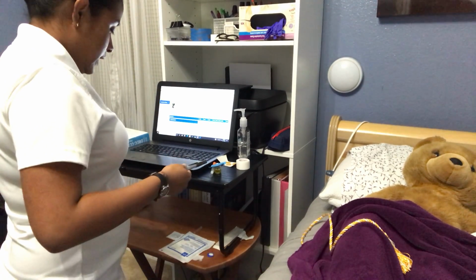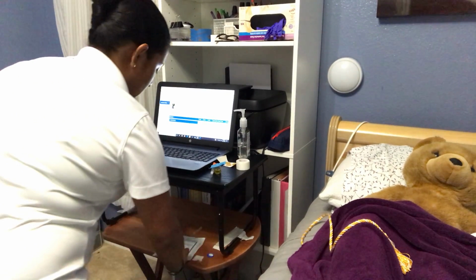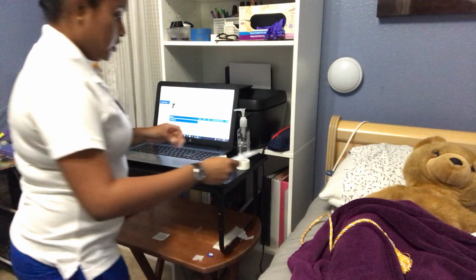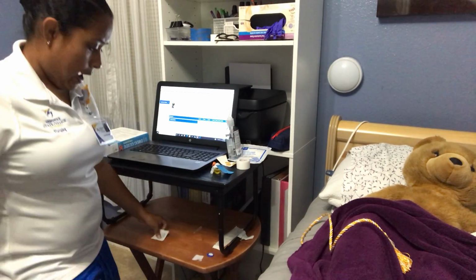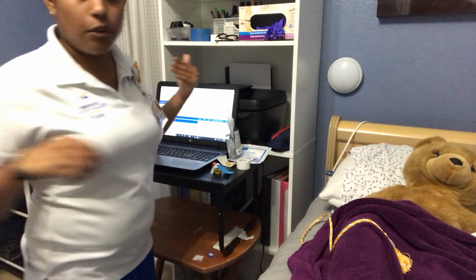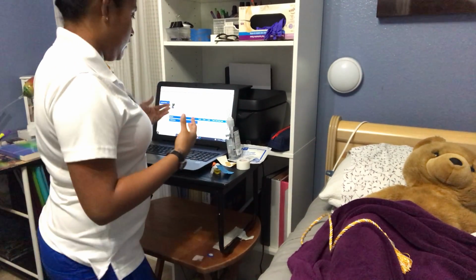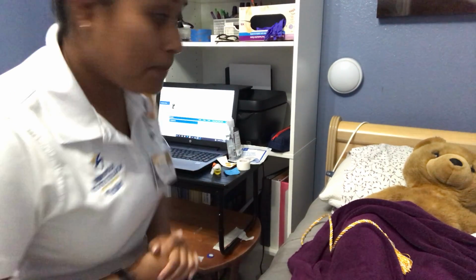All right. Next thing, before I go to the patient's room, I'm going to get a woven gauze sponge just in case for any bleeding. Next thing I'm going to do is also get an alcohol pad to cleanse the skin. And the gloves are provided in the room, and hand sanitizer is provided in the room. All right. Now that I have all my necessary materials, I'm going to go inside the patient's room.